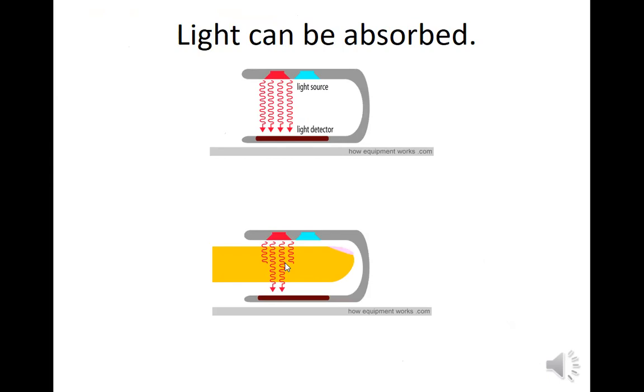Infrared is going to be absorbed by oxyhemoglobin, whereas red is going to be absorbed by free hemoglobin, or reduced hemoglobin. It's the same thing. So the sensor is on the bottom. If fewer photons, or LED light-emitting diode light, reach the sensor, that means it's being absorbed. It's not getting to the sensor. And that's how it calculates it, basically.